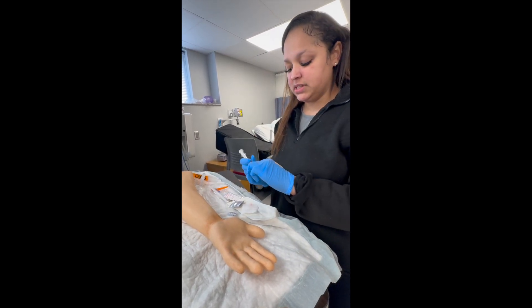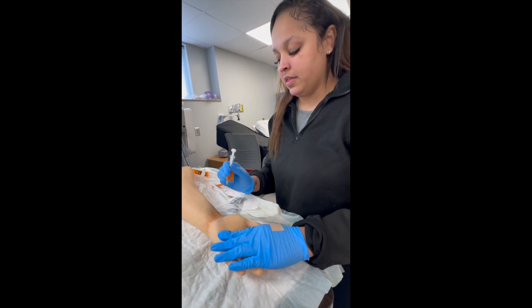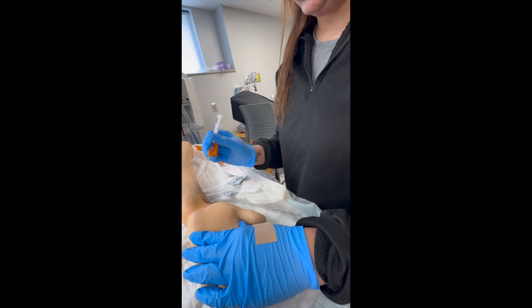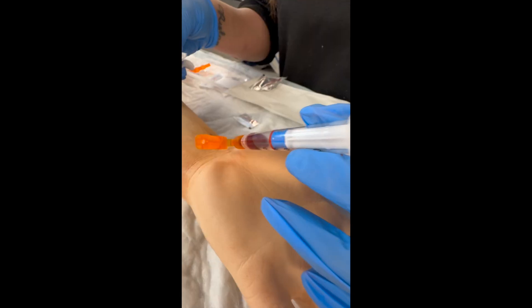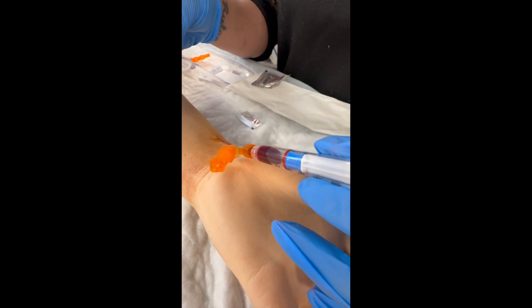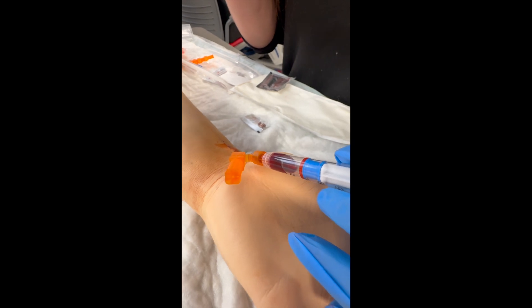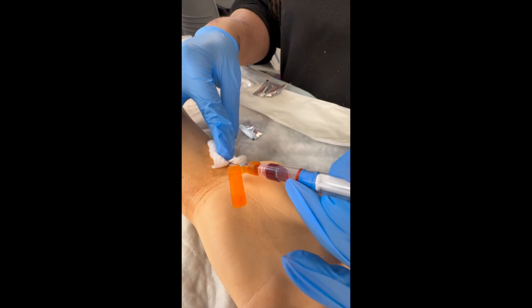After you've cleaned the site and your bevel is up, you can remove your cap. A 30 degree angle is best when trying to get the blood gas. After the syringe is full, you'll remove the needle.